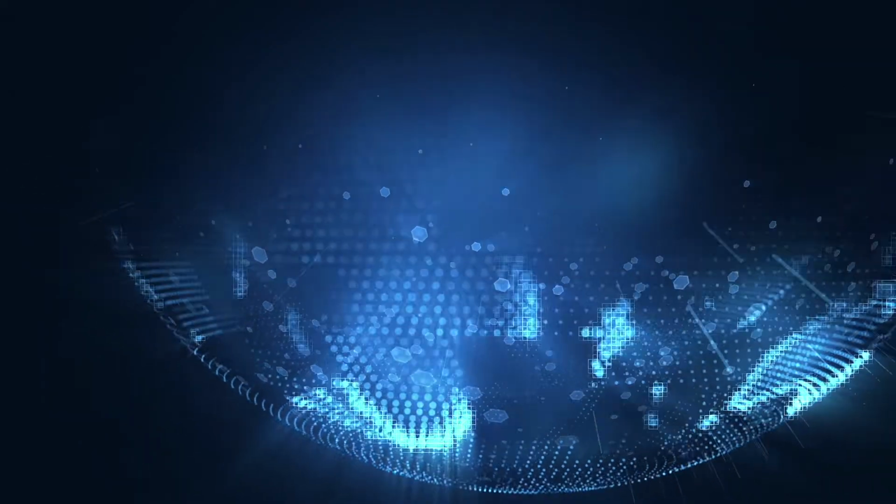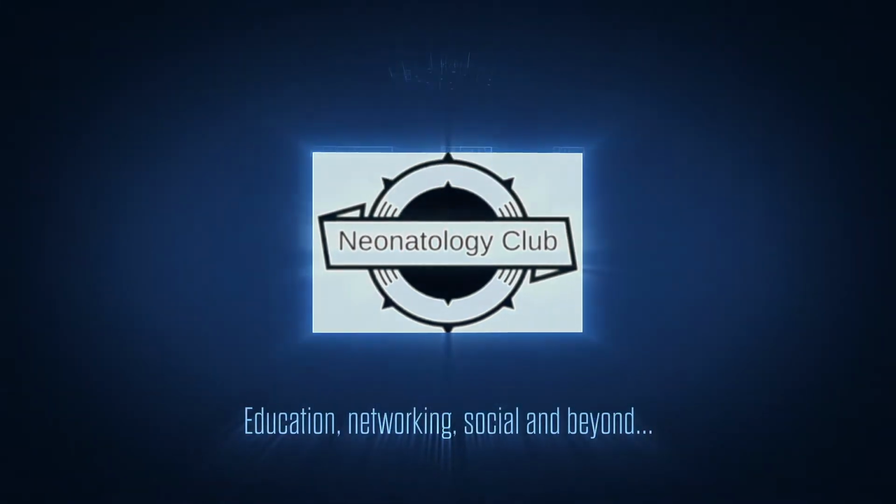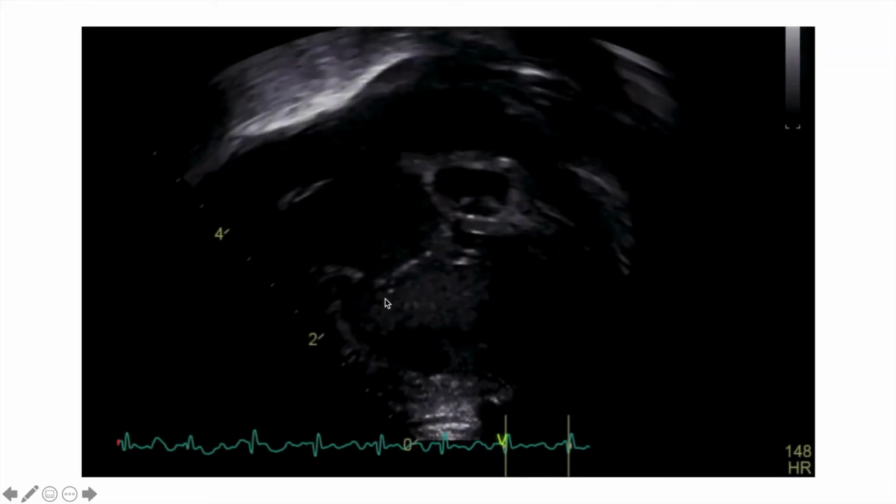Some people do the FAC, which is the fractional area change, on the apical view, but you can also use the same principle to calculate the FAC from this new view, which is the RV 3-chamber view. So here you go. This is the view I'm talking about.